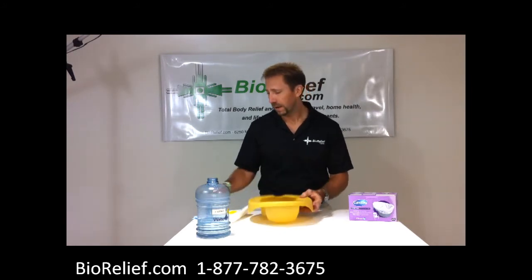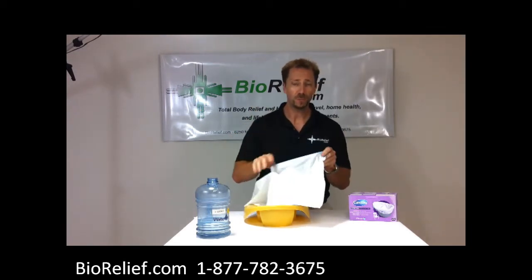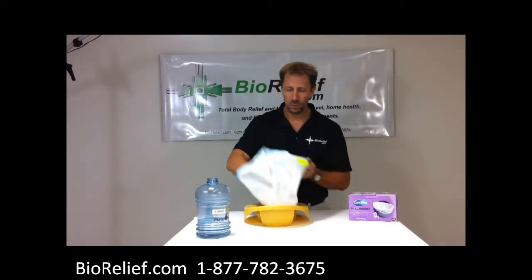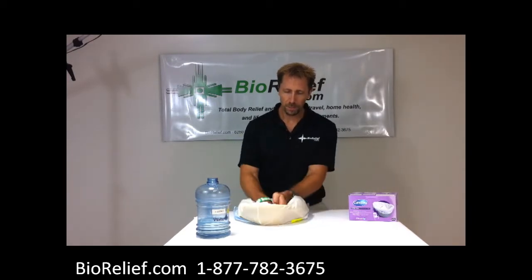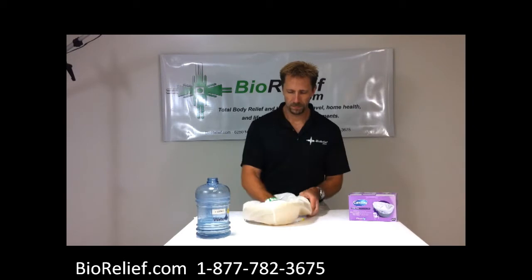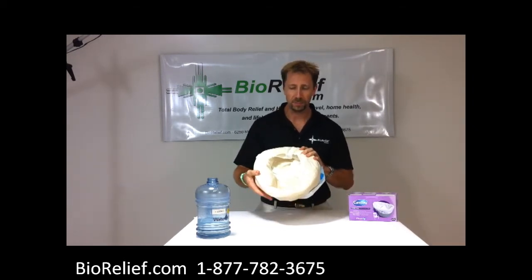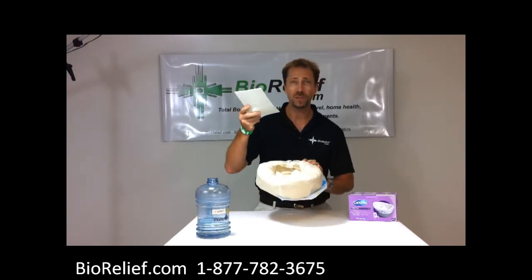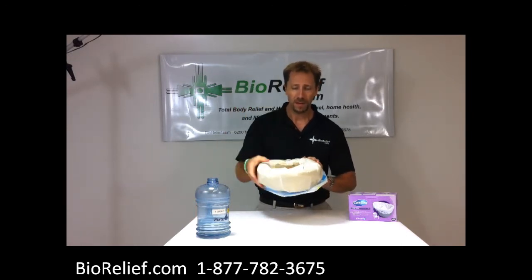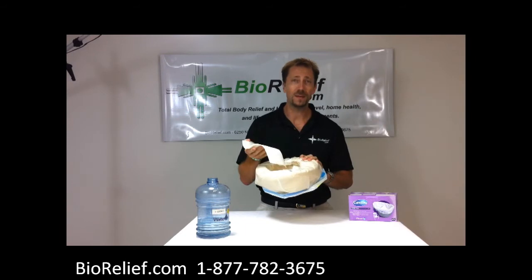Here we have a standard bedpan, and what we have here is just what resembles a trash bag that has drawstrings on it. What you do is you place the liner over the bedpan, so now you can see that the liner is pretty much covering the bedpan. You have an absorbency towel that comes with each bag — you lay that on top. This is the same type of material that's impregnated in diapers and other types of devices that absorb liquid.